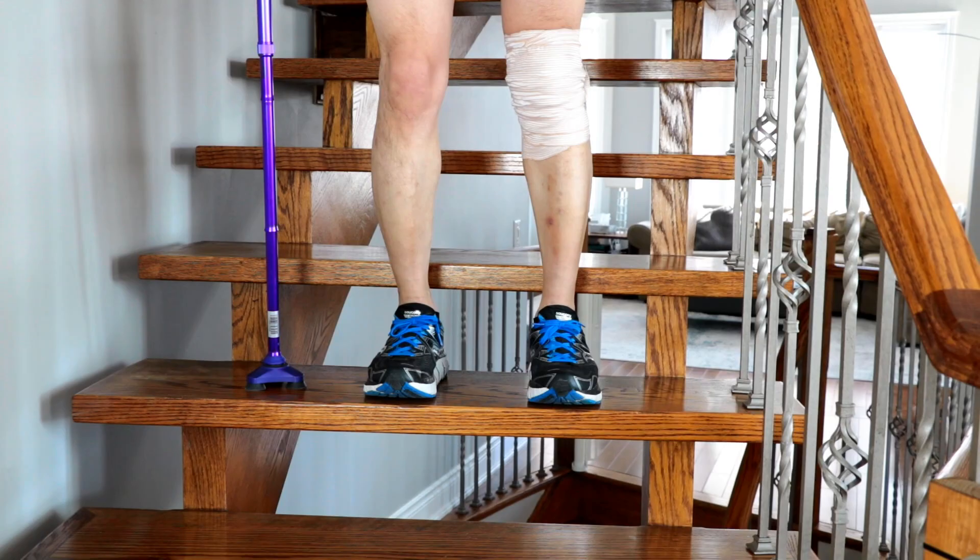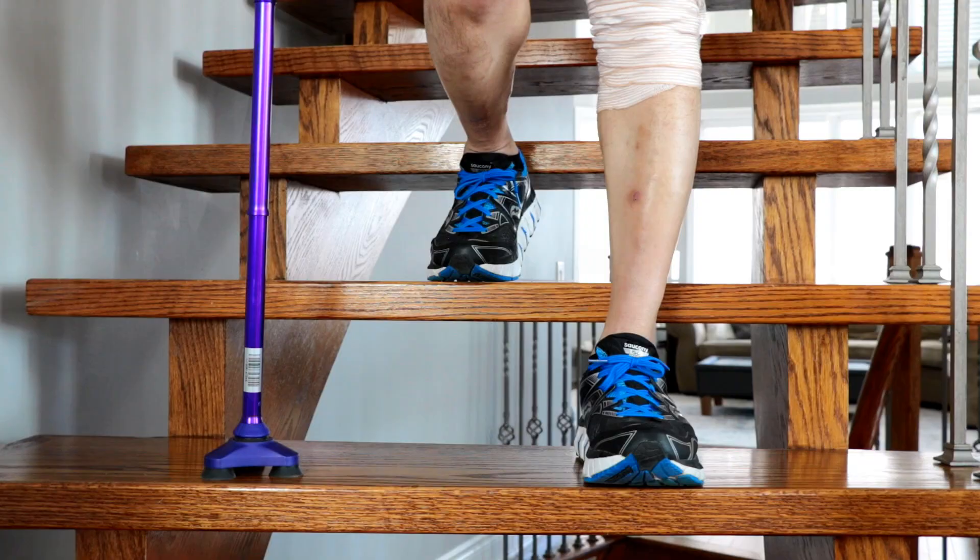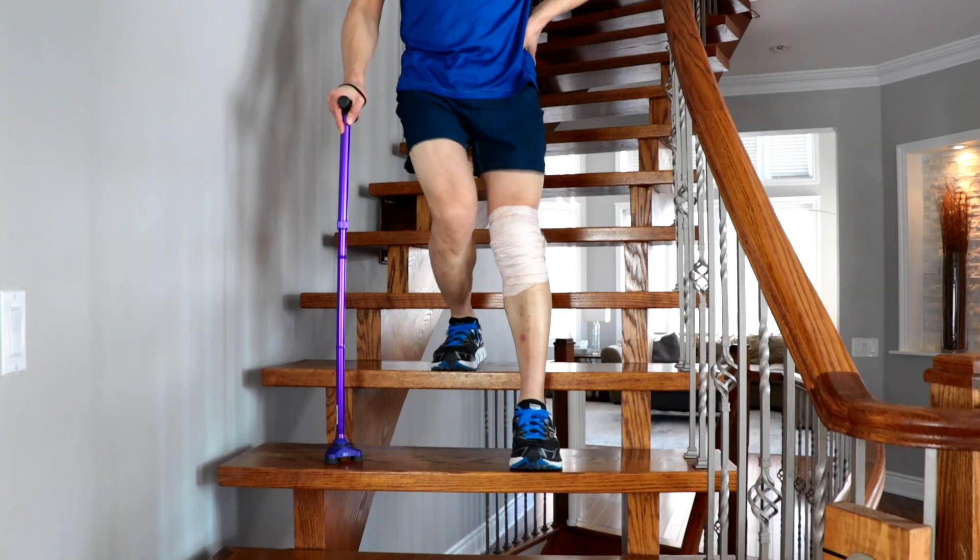Begin by standing on the strong leg and lowering the cane and injured limb to the stair. You can then move the strong leg down to meet them. This pattern repeats until you reach the bottom of the staircase.